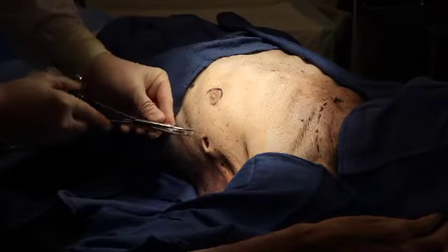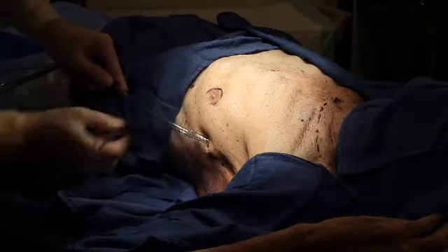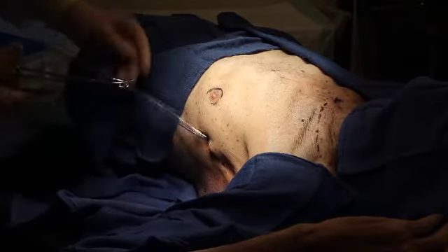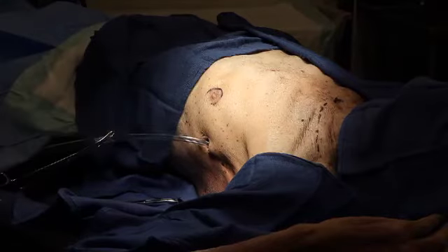An appropriately sized chest tube is advanced into the pleural cavity through the previously created tract and directed posteriorly along the inside of the chest wall and towards the apex of the lung until all of the drainage holes on the tube are inside the chest.